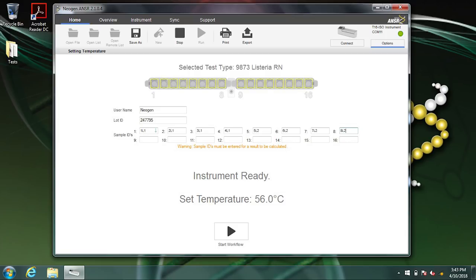Fill in the username and lot ID from the kit and corresponding labels from your samples in the sample IDs. These should match the cluster tubes as well. If you do not put in a sample ID next to the well number, the reader won't read it even if it has a sample. Be sure to provide an ID for every well you're running.